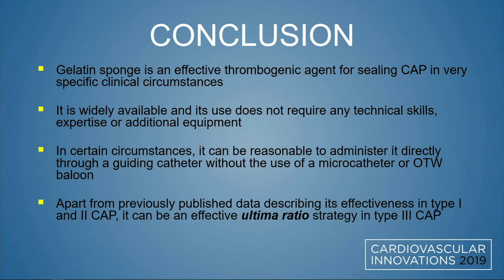As a method that results in total occlusion and iatrogenic myocardial infarction, it should be considered in patients with CTO when other embolization methods are deemed ineffective or are not available, and with limited deliverability of the stent graft. So it's an extraordinary case. Thank you.